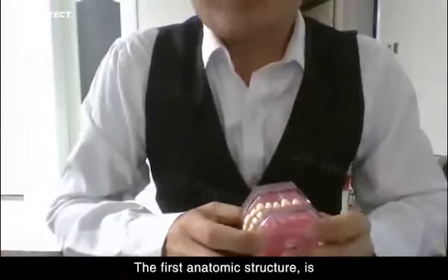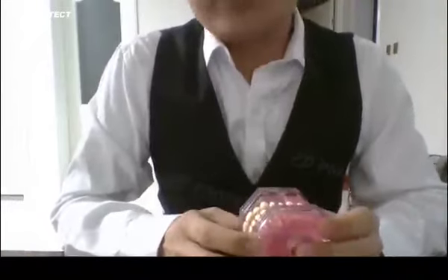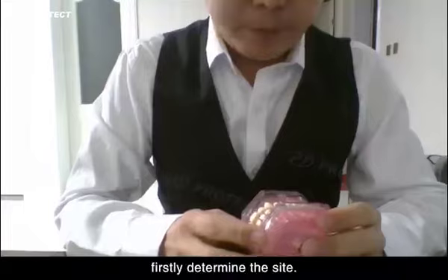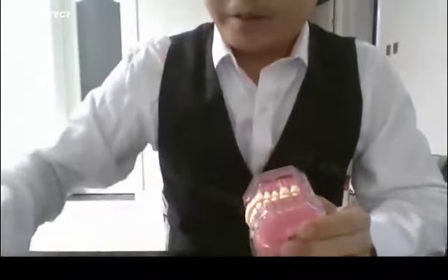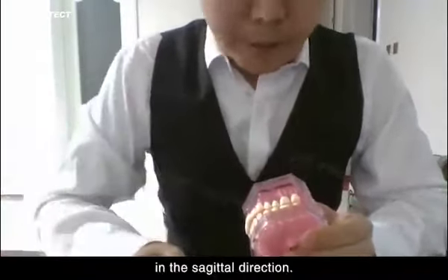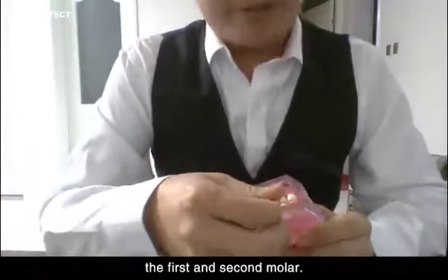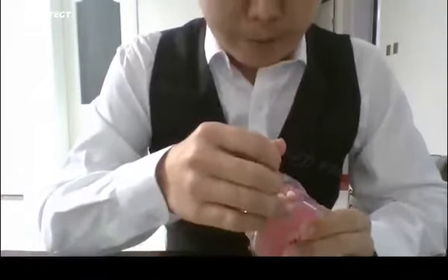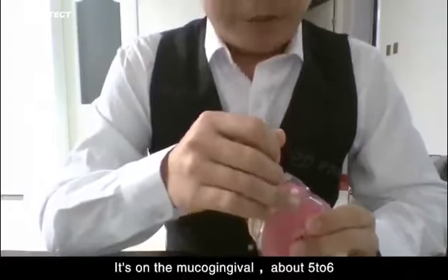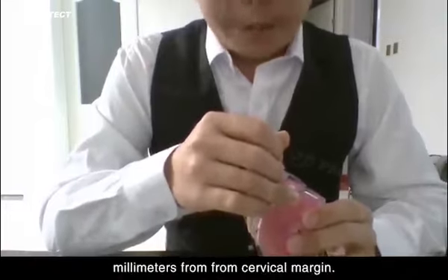The first anatomic structure is the zygomatic ridge. First, determine the site. We can touch it with our finger. In the sagittal direction, it's on the midpoint between the first and the second molar. In the vertical direction, it's on the mucogingiva, about 5 to 6 millimeters from the cervical margin.